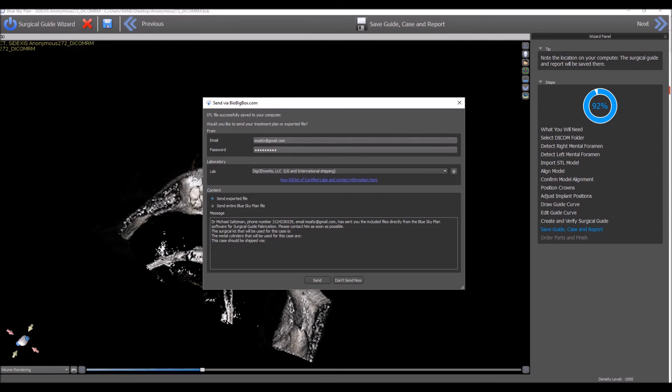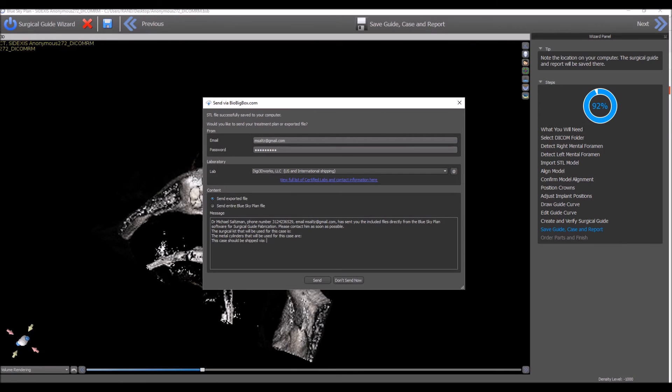Once everything is complete, you press the send button or press don't send now to just cancel out of the screen. Once you press send, the transfer indicator will appear on the bottom left and your case will be sent to the lab.